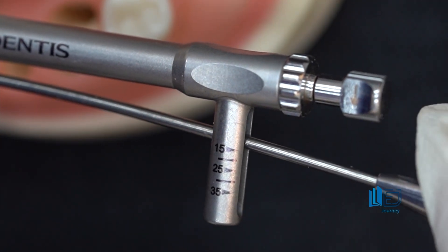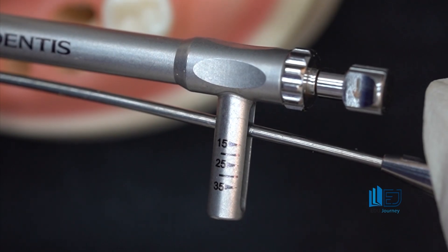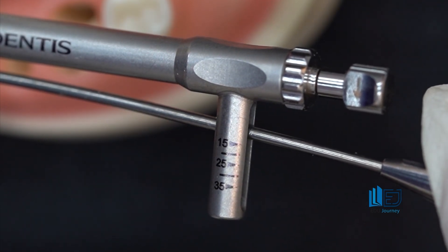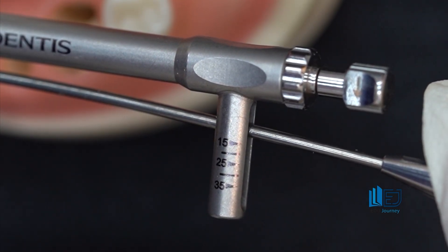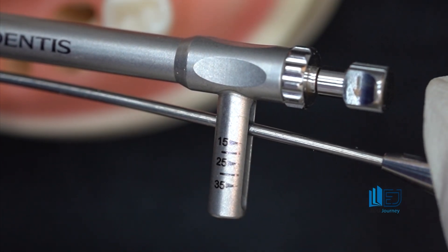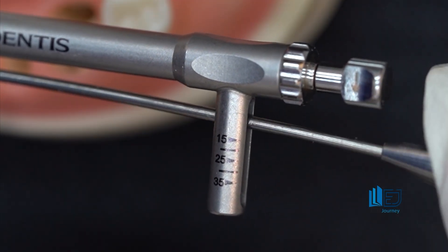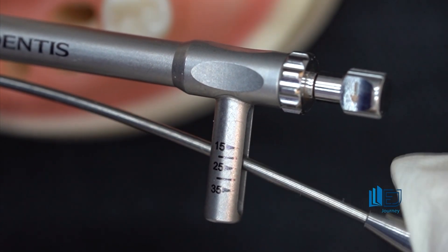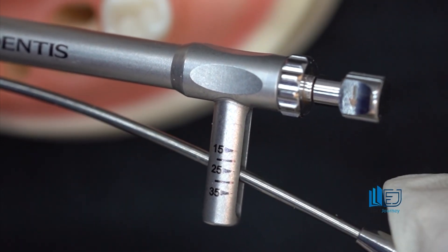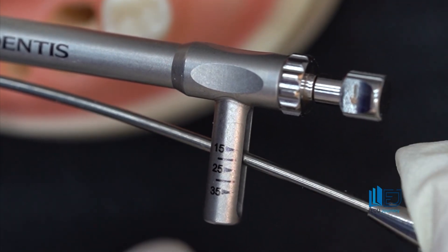But if this number is lower — if it is below 20 or 30 newton centimeters — you shouldn't take risks and should use a cover screw so that chewing forces during osseointegration don't put pressure on the fixture and don't jeopardize integration. Therefore, the final torque number during implant insertion is important, and it determines whether you do single-stage or two-stage surgery.